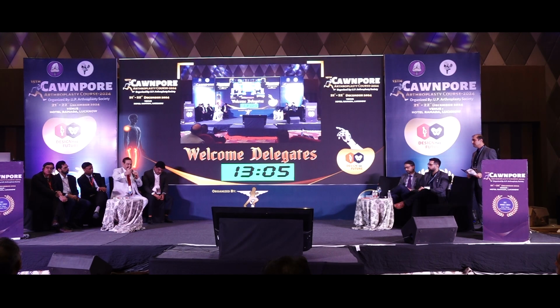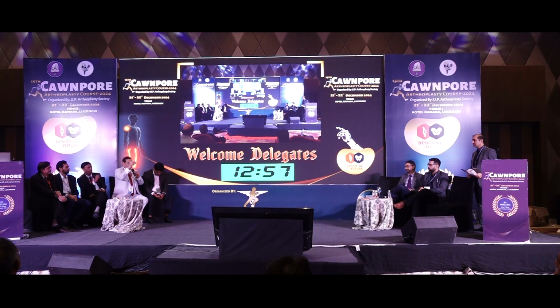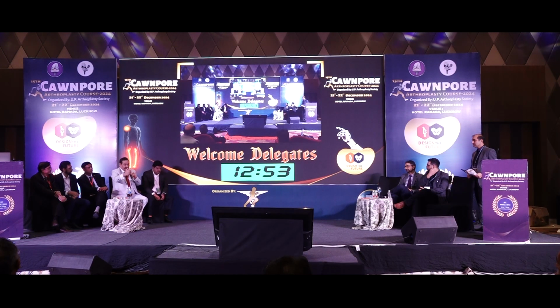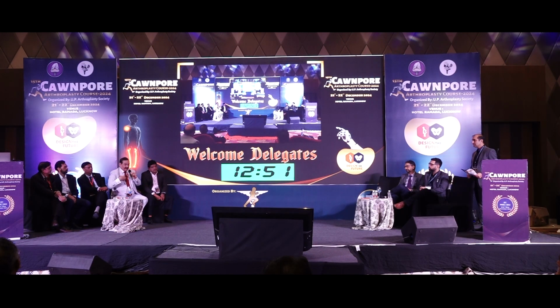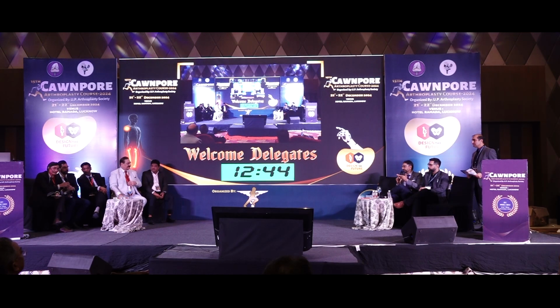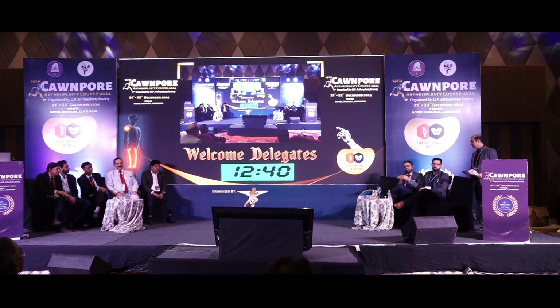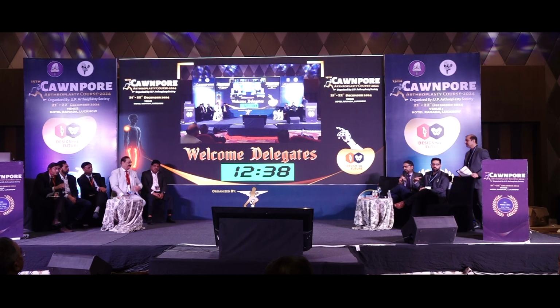I hope I have conveyed the message I wanted to convey. Preoperatively, have mental templating: where your cup will be, how much outside it will be, or whether it will be inside the bony margin, the lateral most you're seeing. And on table, you reproduce that. That works very practically in my hands, that I so call mental templating. I think you can use the C-arm when in doubt. There's no problem in that. You can always take the C-arm from the other OT, just put on new covers and then put it back, no problem.